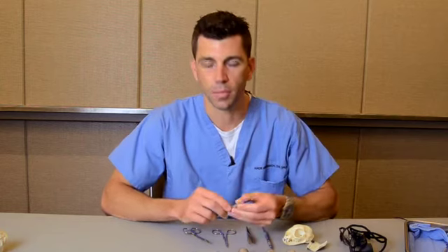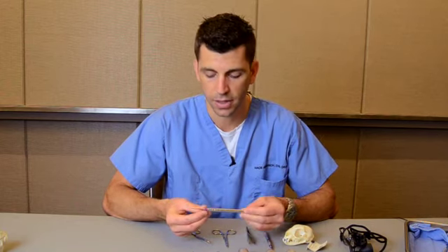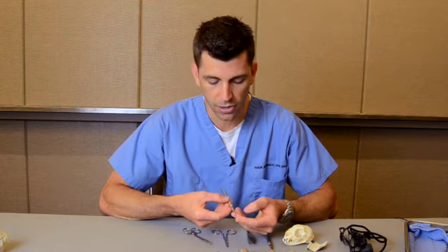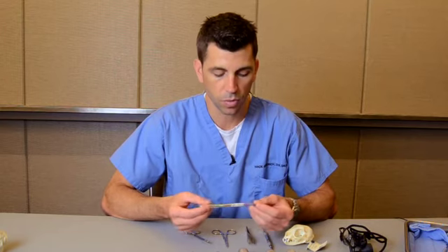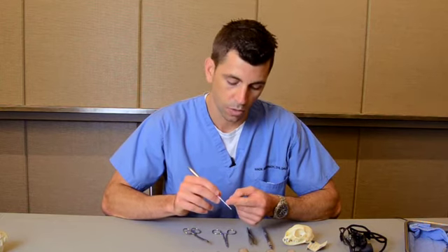If you do run into complications, a small root tip pick can be a helpful tool. And I have one of these in all of my feline extraction packs as well as the canine extraction packs. This is a very fine and sharp instrument. It's also a very dangerous instrument. So it's extremely important that when you're using it, you use it properly and that you do not apply a lot of force towards the tooth in an apical direction, okay?